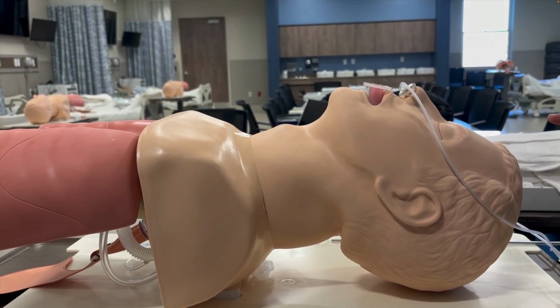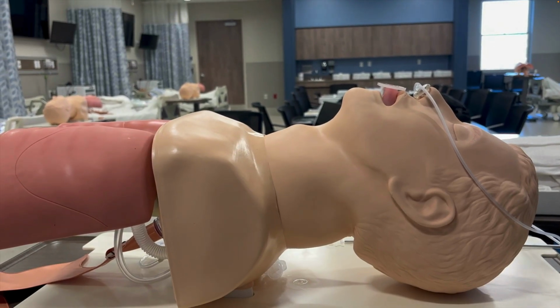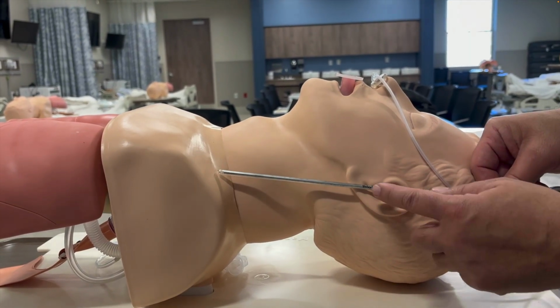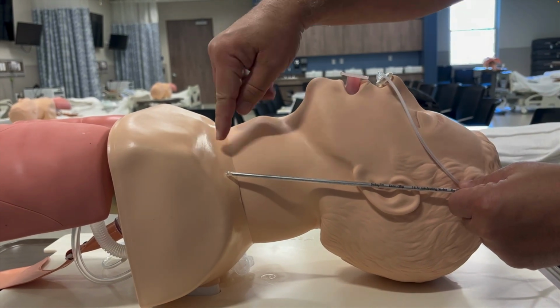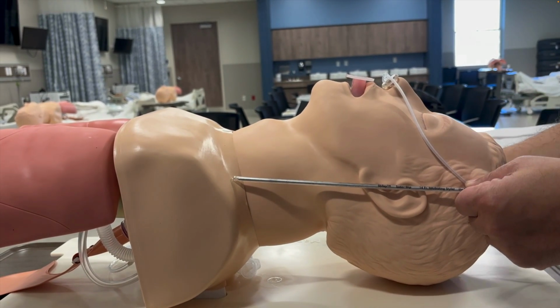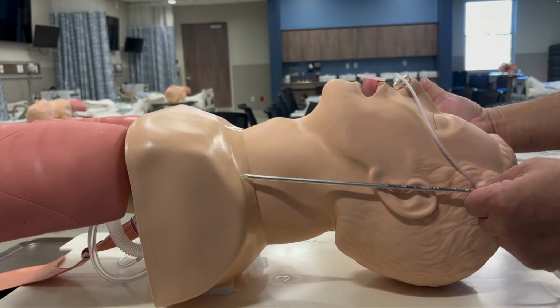One of the important components is correct positioning of the patient, especially to align all the axes of the airway in almost a straight line. If you'll notice here the ear to sternal notch, here is the ear and the sternal notch is here, we want to get those parallel to the ceiling. And so the head needs to be ramped up in order to do that.